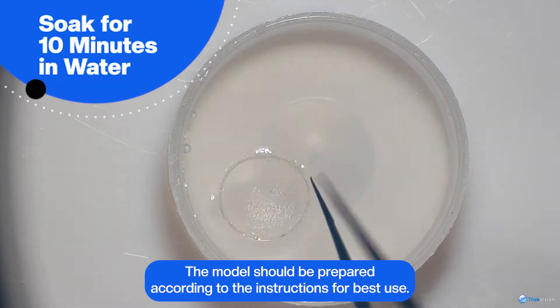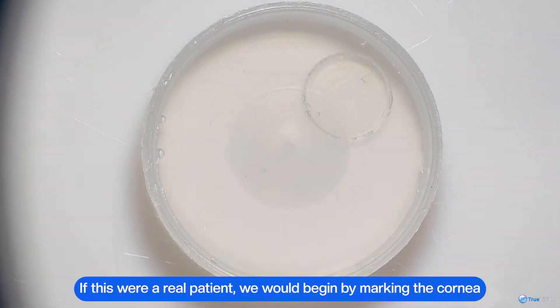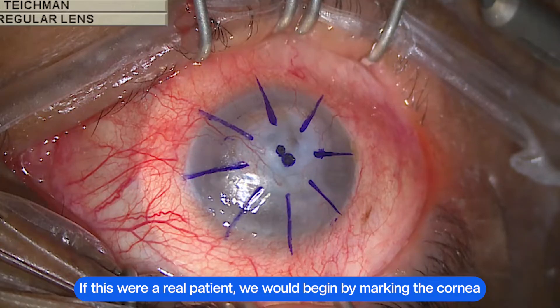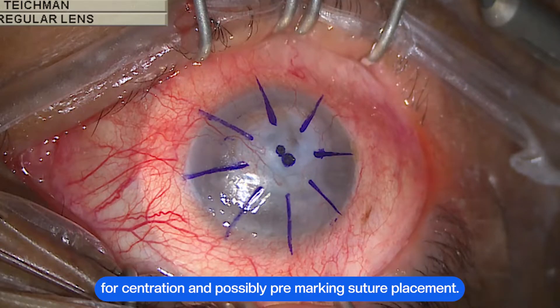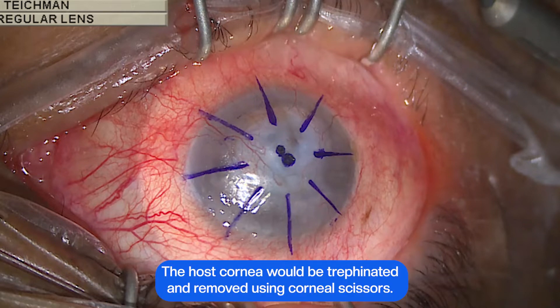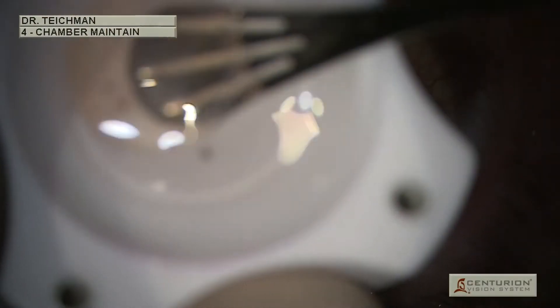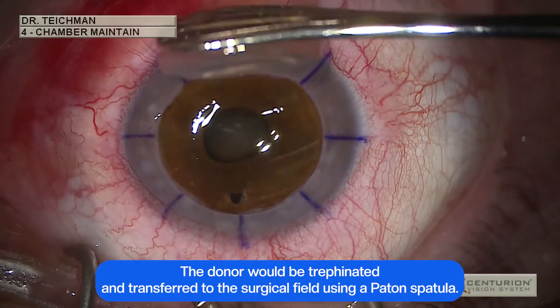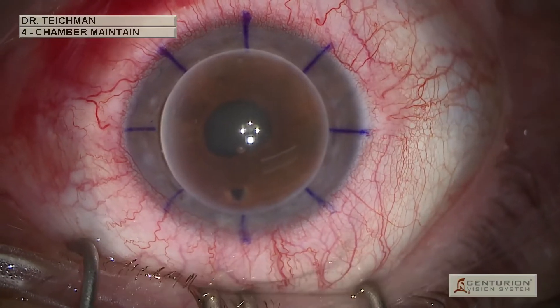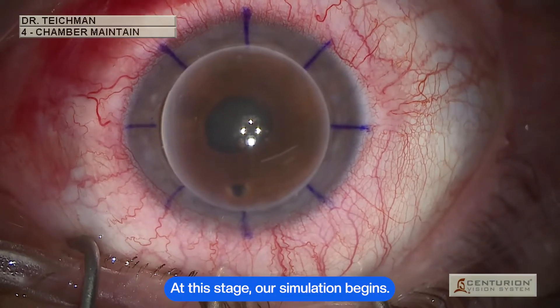The model should be prepared according to the instructions for best use. If this were a real patient, we would begin by marking the cornea for centration and possibly pre-marking suture placement. The host cornea would be trephinated and removed using corneal scissors. The donor would be trephinated and transferred to the surgical field using a patent spatula. At this stage, our simulation begins.